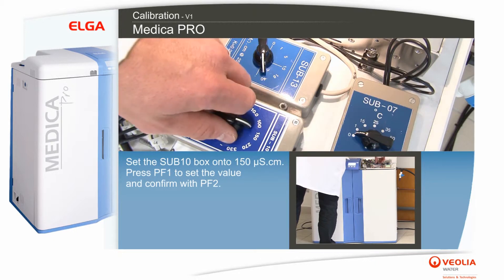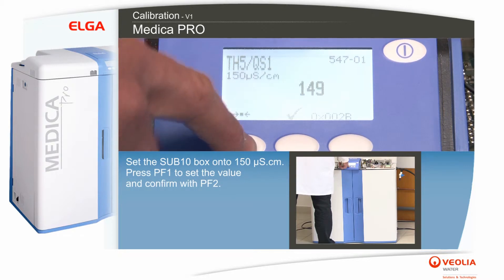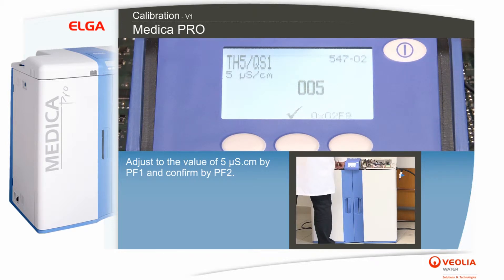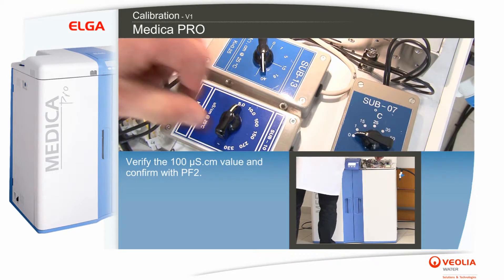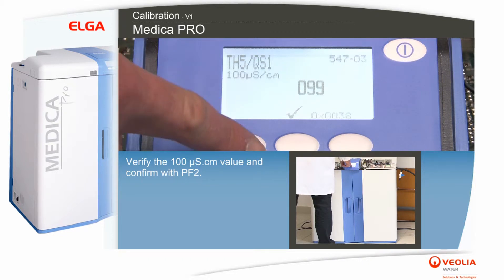Set the sub-10 box to 150 microsiemens per centimeter. Press PF1 to set the value and confirm with PF2. Adjust to the value of 5 microsiemens per centimeter with PF1 and confirm with PF2. Verify the 100 microsiemens per centimeter value and confirm with PF2.